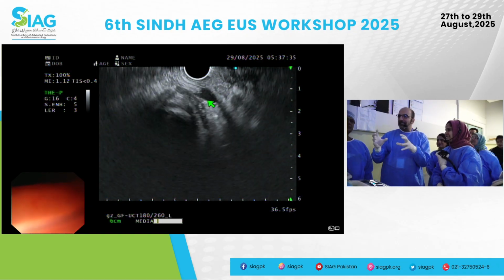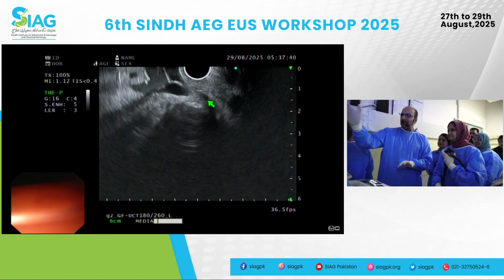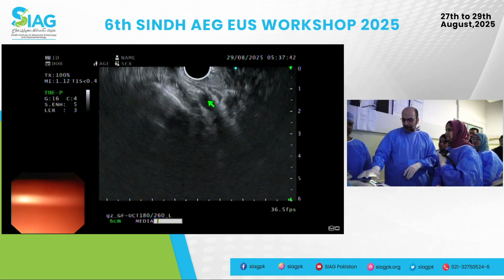See, sometimes it's really simple and it's in front of you, but we overthink it. Yeah, which is okay. I think it's the nervousness of the situation, because I know yesterday you were doing just fine. So let me see that bile duct again.